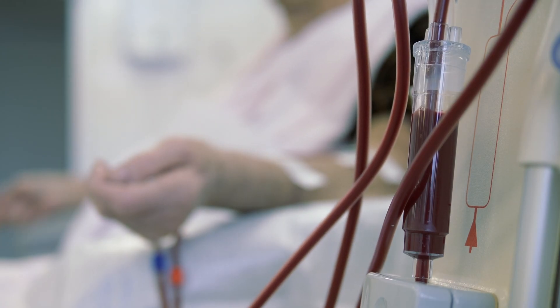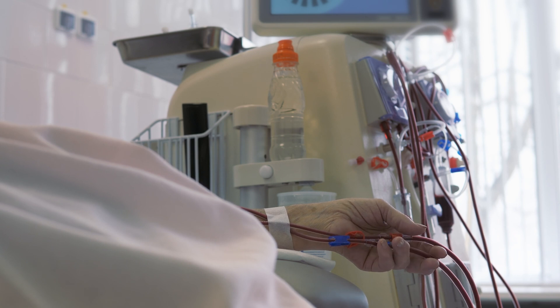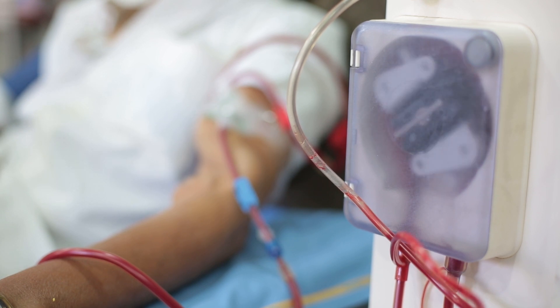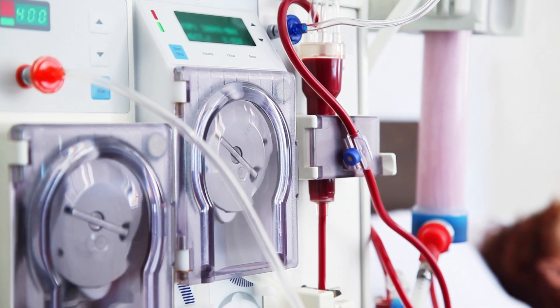Before beginning the disinfection process, you must ensure that the patient has left the station. Patients should not be removed from the station until their treatment has been completed and they are clinically stable. If for some reason the patient cannot be moved safely, disinfection of the station and machine should be delayed until the patient can safely be removed from the area.